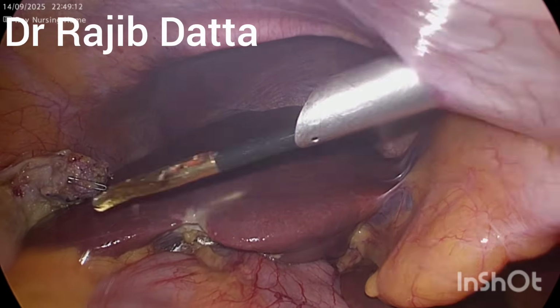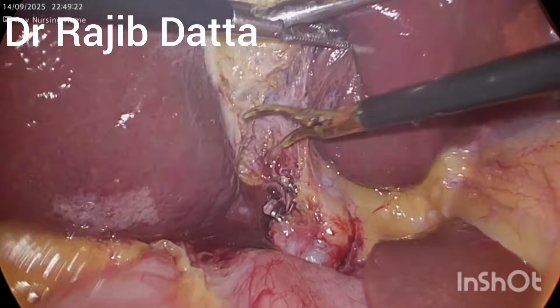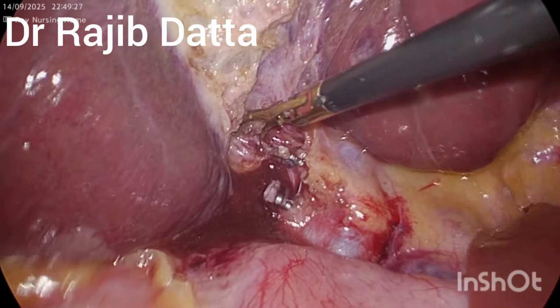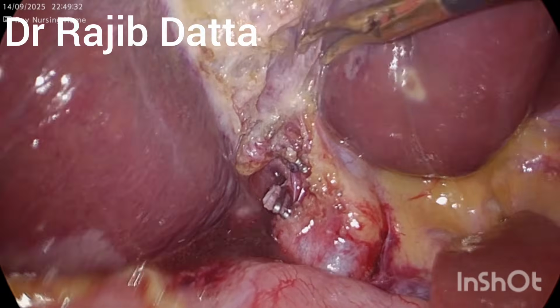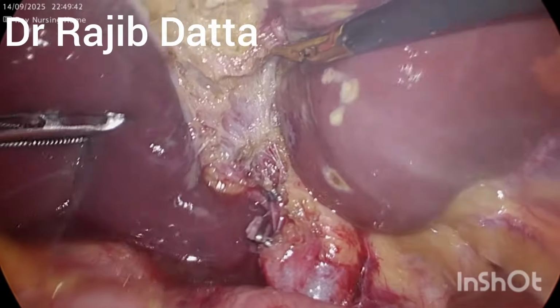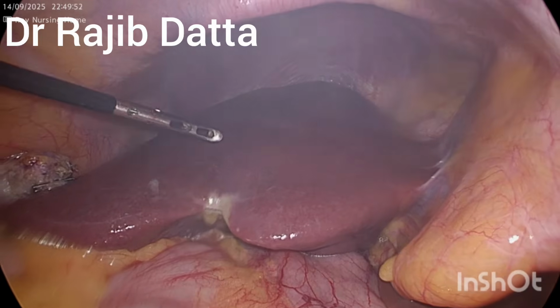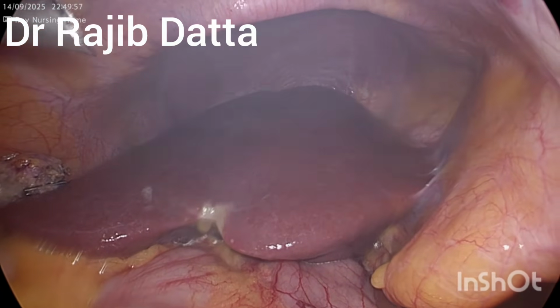Here we are first checking whether bleeding is present or not, and doing proper hemostasis near the liver bed with the bipolar shearer. The gallbladder has to be extracted out through the umbilical port with the help of the endo bag. Here the glove has been used for retrieval of the gallbladder as an endo bag.